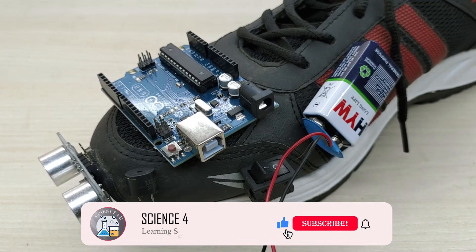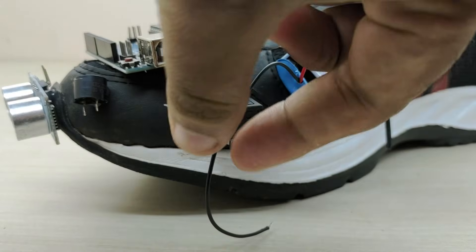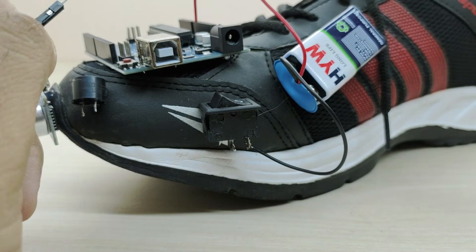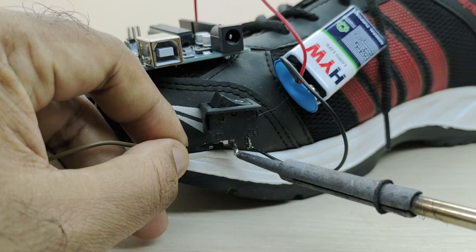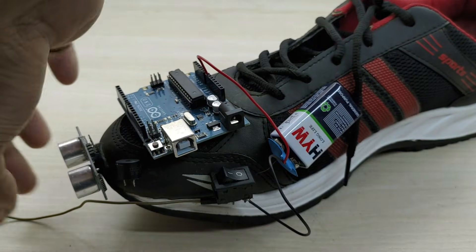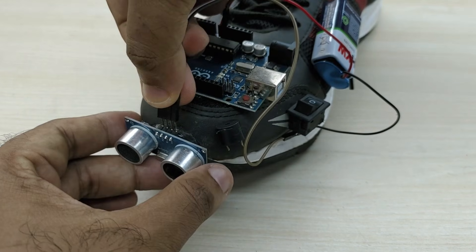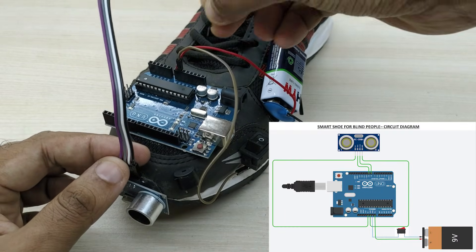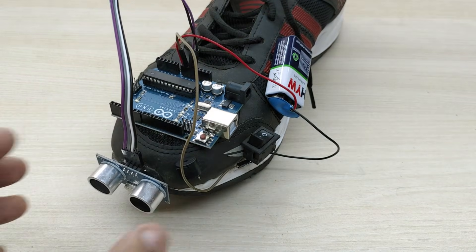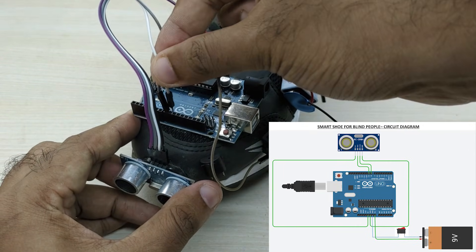Now let us give the electrical connections. First, connect a wire from the positive terminal of the battery to the VIN pin of Arduino. Connect the wire from the negative terminal of the battery to one end of the switch. Take a jumper wire and connect one end to the other terminal of the switch, then connect this jumper wire to the ground pin of the Arduino. Take a jumper wire and connect the VCC pin of the ultrasonic sensor to the +5V pin of Arduino, and the ground pin of the sensor to the ground pin of Arduino. Connect the echo pin of the ultrasonic sensor to pin number 8 of Arduino and the trigger pin of the sensor to pin number 9 of Arduino respectively.